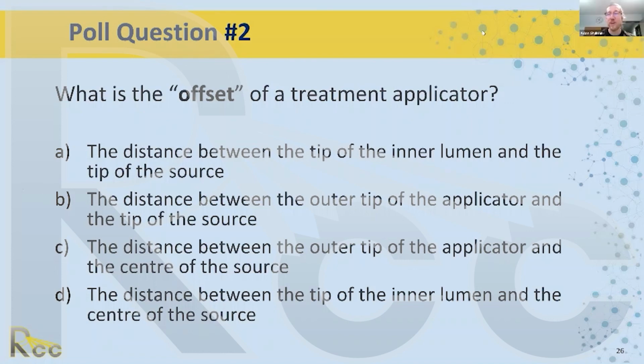And we actually use our marker wires here. So there are a couple of different methods. Like Sonja said, that's a great method where you can basically measure your offset with your marker, measure your offset with your autoradiograph, and make sure that they're the same to the center of both sources. If you get your technique right using electrons, like Sonja suggested earlier, you can use your electrons to make an exposure on your Gafchromic film with the marker wire in it. You'll see the outline of the applicator. You'll see that first marker looking bright on your film as well.